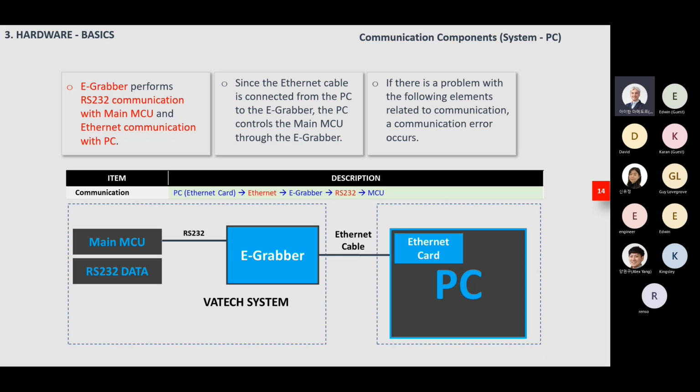But the last slide related to this eGrabber and the connection between the PC and the device is that this eGrabber performs the communication with the main MCU using the RS-232 cable, all right?